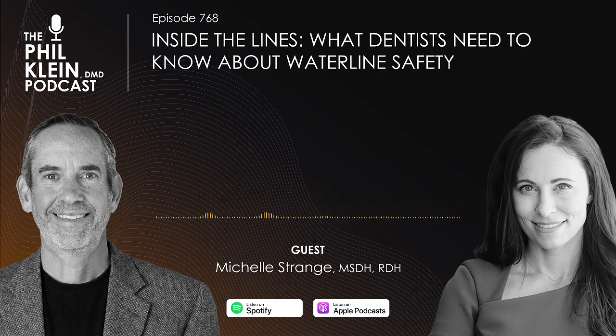A lot of these dental units these days want tap water. But some people are still using distilled or maybe reverse osmosis, maybe even ozone. So there are different sources, obviously, but that water bottle system is very important because that is how you're going to be able to apply your treatment or your maintenance. We can break down the cartridge and straws in a second, or that's how you're going to shock. If you don't have a bottle system, we cannot do all those things.